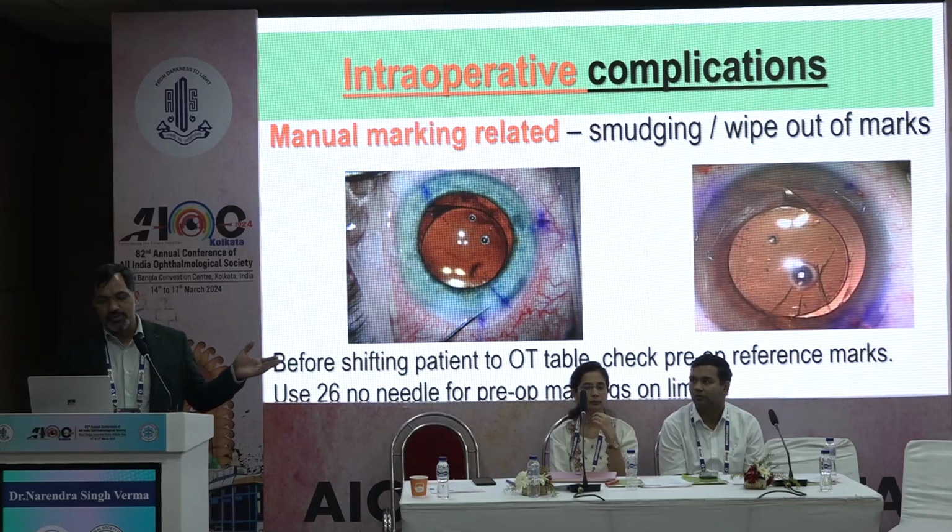As Dr. Swapnil told, it is better to use a 26 number needle for preoperative marking because the marks will last longer and they will not wipe out. So we can overcome this problem by using a 26 number needle for preoperative marking.